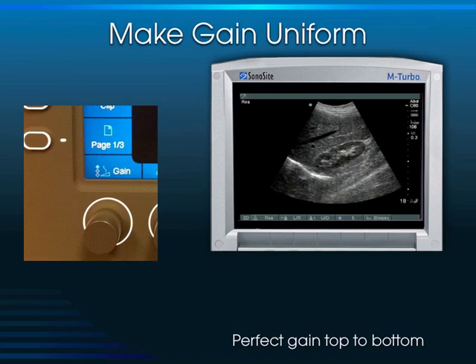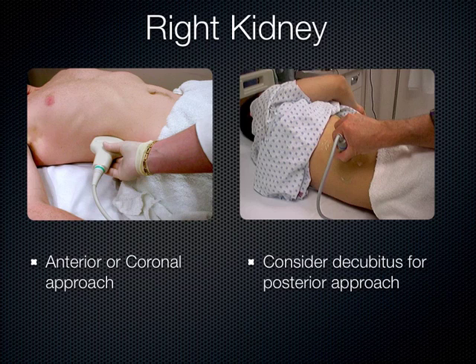Make sense? I'm just trying to get you to think about some of the art of this. We're going to move on now. How do you actually scan the kidney?